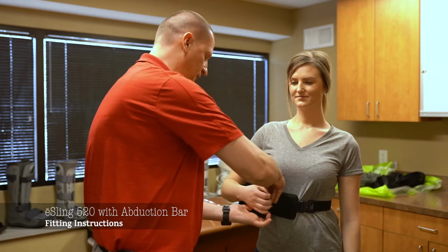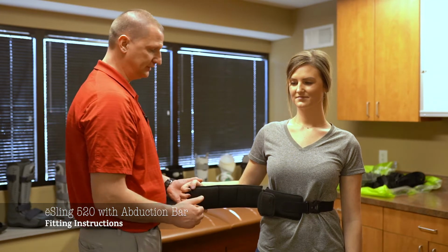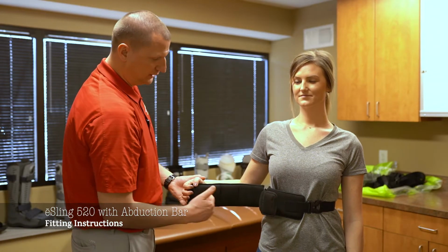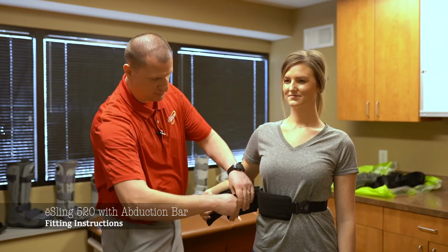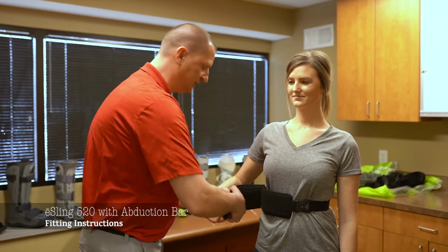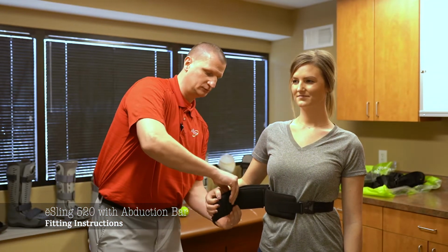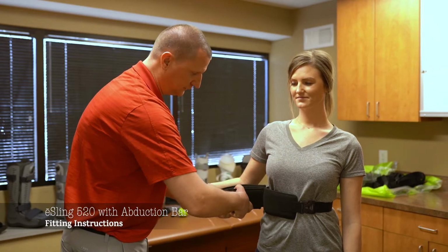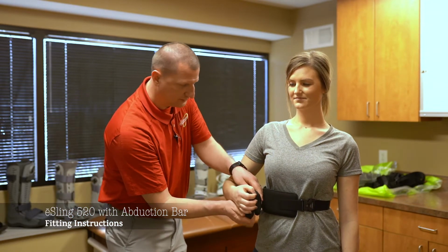You can also bring her out into 30 degrees external rotation, aka gunslinger, which is basically 30 degrees from her neutral position. Every time we bring this strut to the rail, we need to make sure that this is bent and is making as flush a contact as possible, so the patient is secure within the torso harness. Once your position is set for this fitting, we're going to use 15-degree abduction.